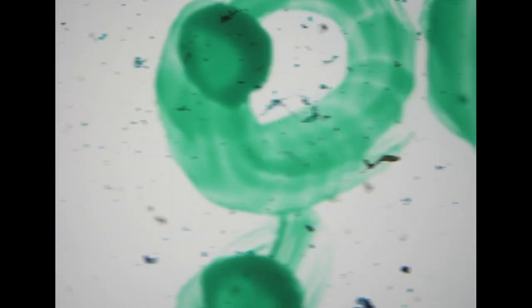The next specimen is also a bone aspiration. It is from the vertebral spine, the T9 segment. The patient had a past history of posterior pharyngeal squamous cell carcinoma.